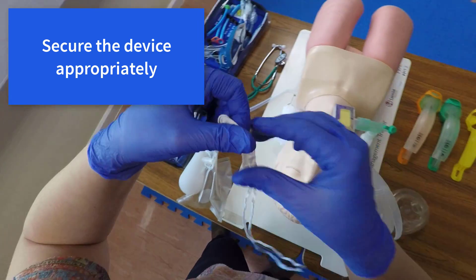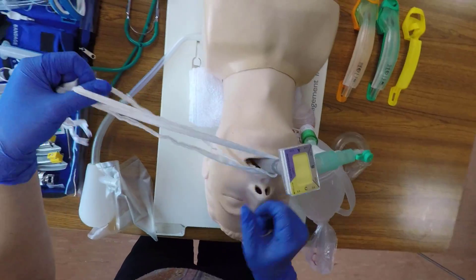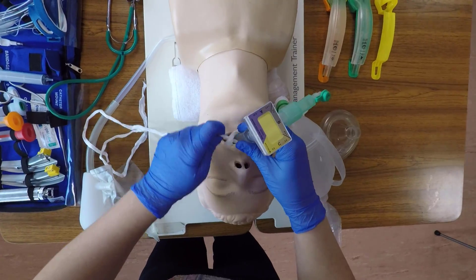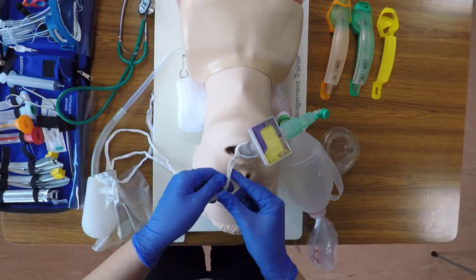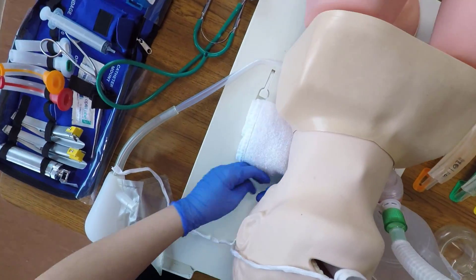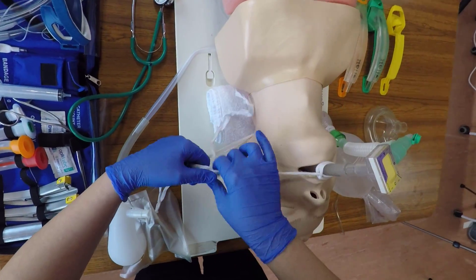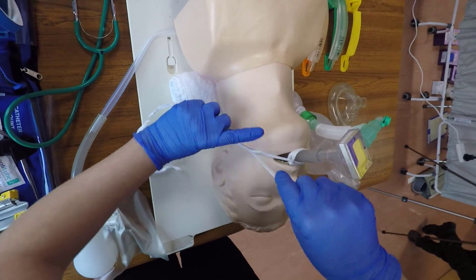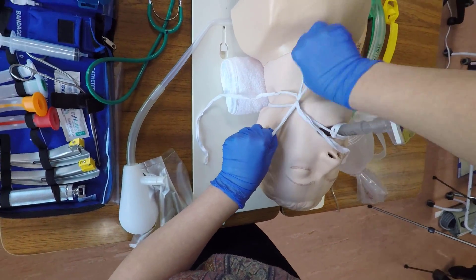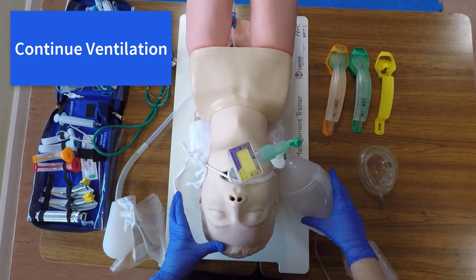The iGel should then be appropriately secured. Continue to ventilate the patient.